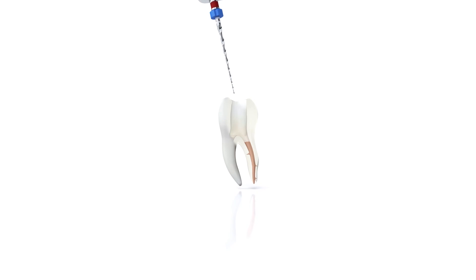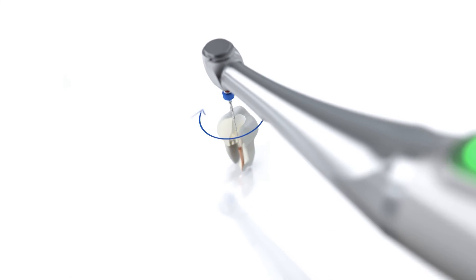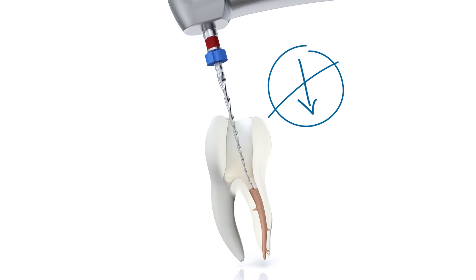Place the tip of the VDW rotate 2505 re-treatment file on the gutta percha. Start the motor and allow the instrument to rotate. The instrument has a cutting tip so it should progress easily into the gutta percha without pressure — no downward pressure is necessary.